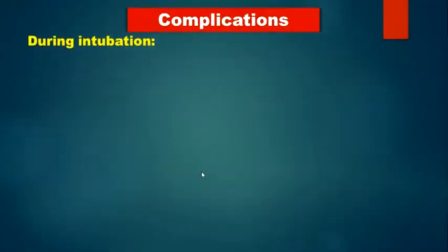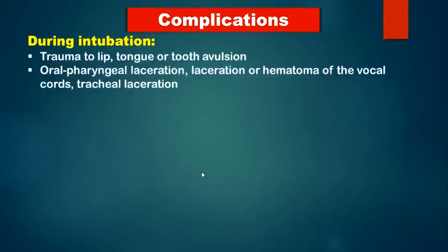Complications. We have complications during the process of intubation, and we have complications during the course of intubation, and we have complications during the extubation. We will know it accordingly.